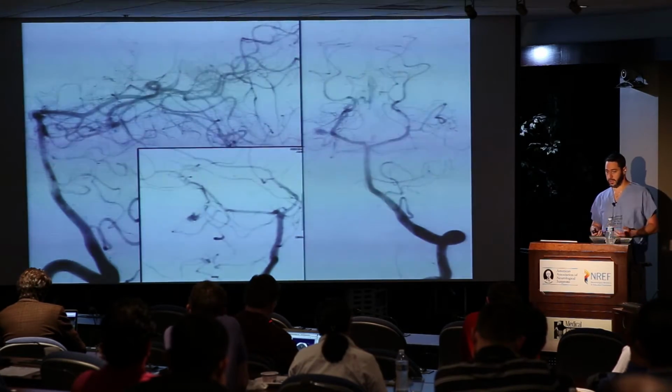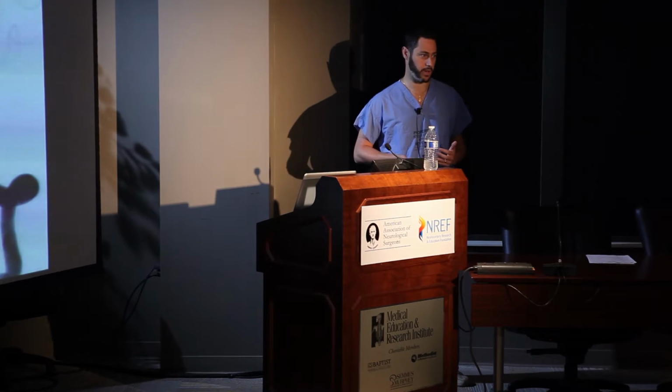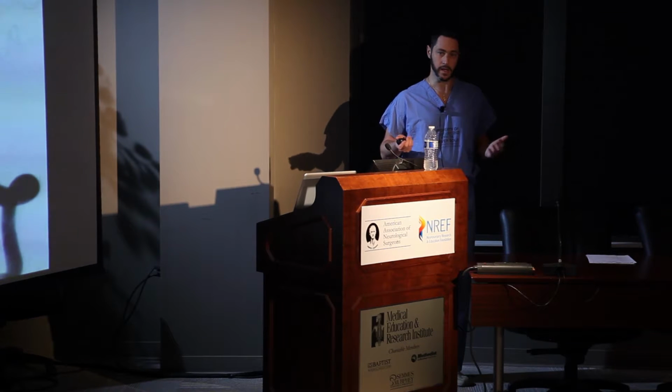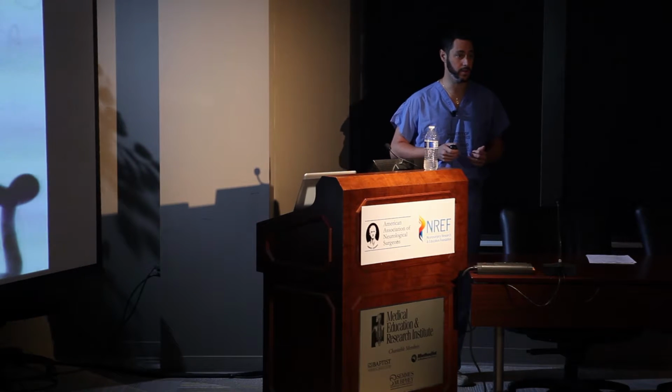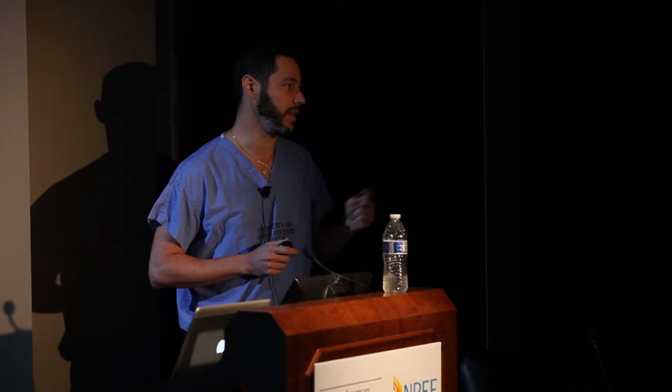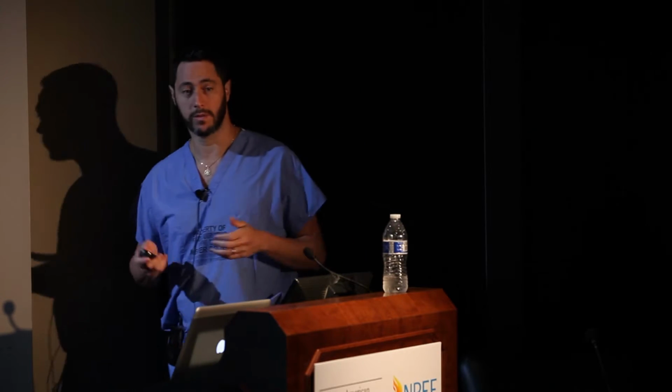When we talked about surgery, not surgery, my plan and the way I do things as an endovascular neurologist is never to go out of the room. We talked about it already. This is, for the most part, a surgical disease. In rare circumstances like this, you may have an opportunity to perform an endovascular curative embolization. I do think those patients need follow-up. They need 6-month angiograms. And when they're younger, the pediatric population will take care of them. For a de novo AVM, we'll do an angiogram 5 years later for those kids. But I'm always prepared with my surgical partners. They know I'm doing the procedure, and basically there's an OR on standby. And we're not starting at 5 p.m.